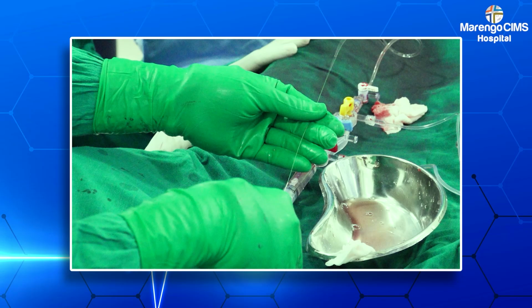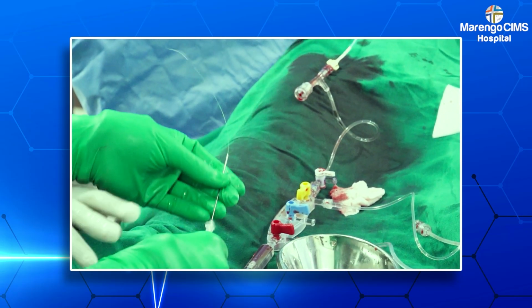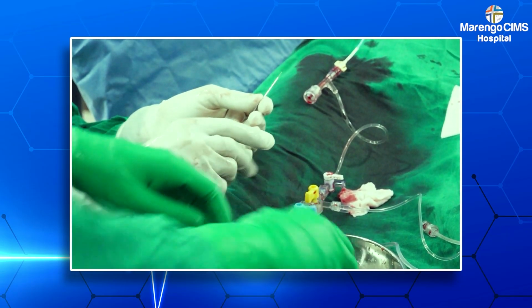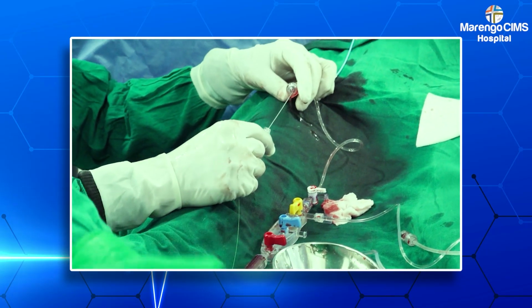Let's open up. Yeah. We can open up the catheter. So we will now show you the catheter now. We can go ahead and start cannulating the renal artery.